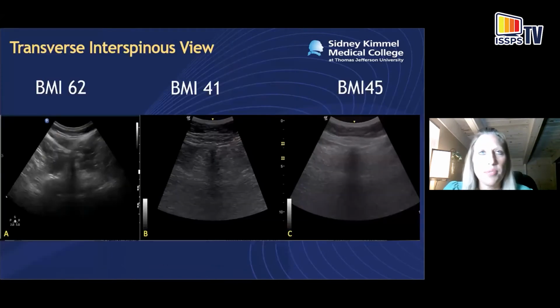Here's just comparing some different views. I thought these views were interesting because we actually found in this case, looking at this transverse interspinous view, that the BMI of 62 patient actually had better spinal sonoanatomy than the lower BMI patient.